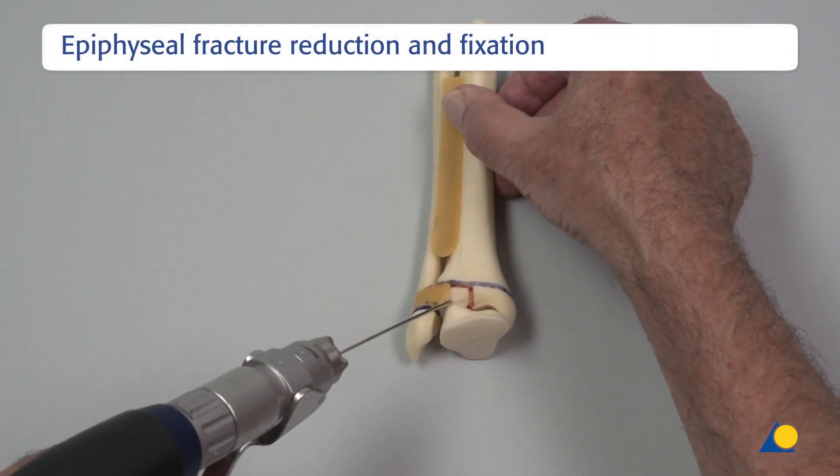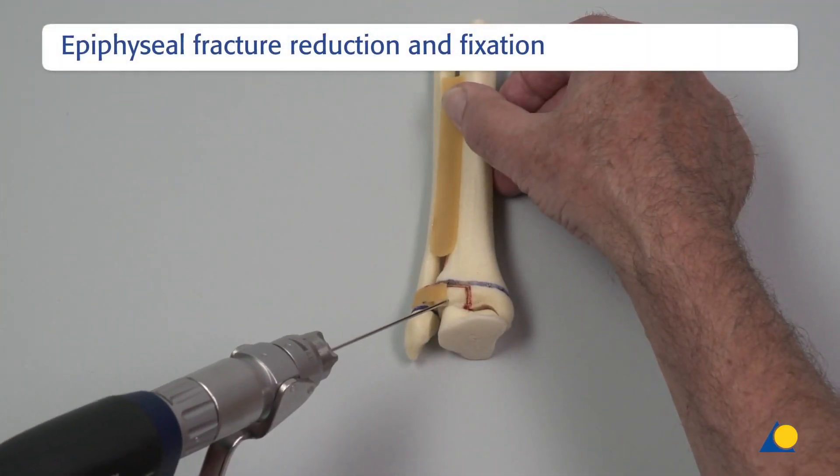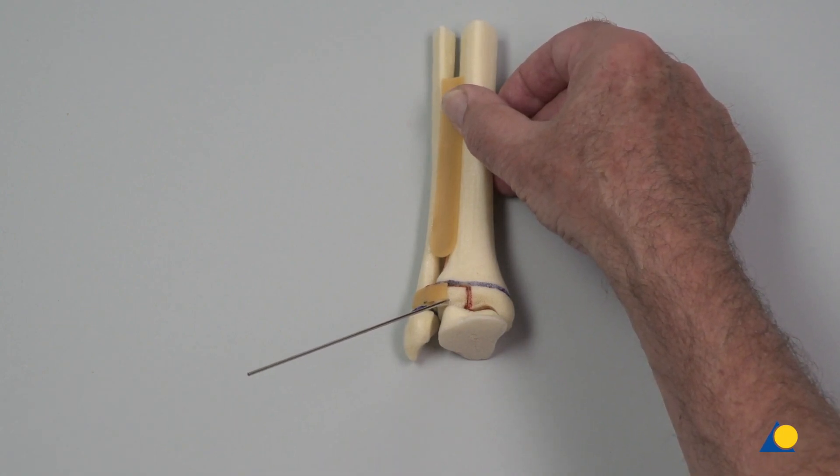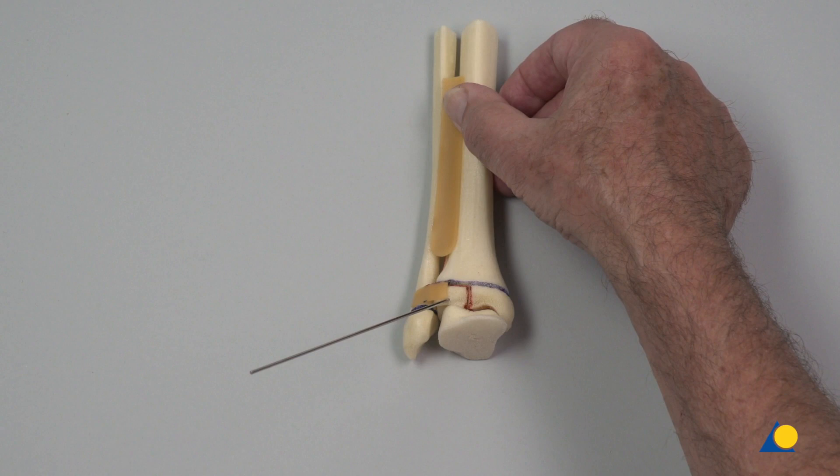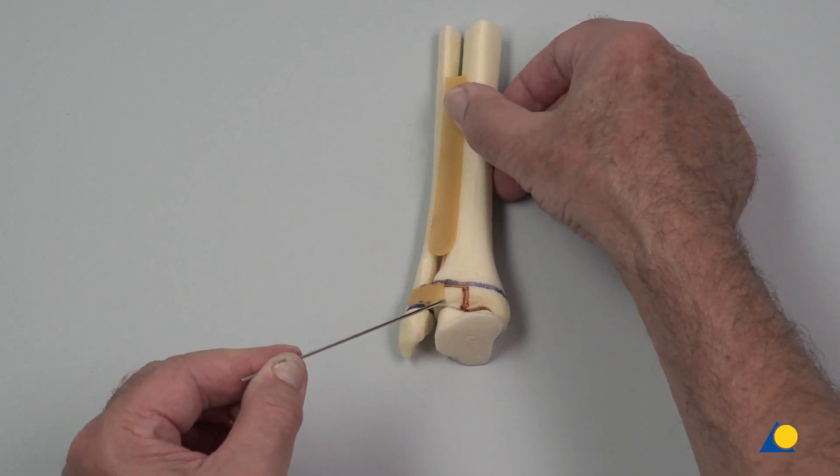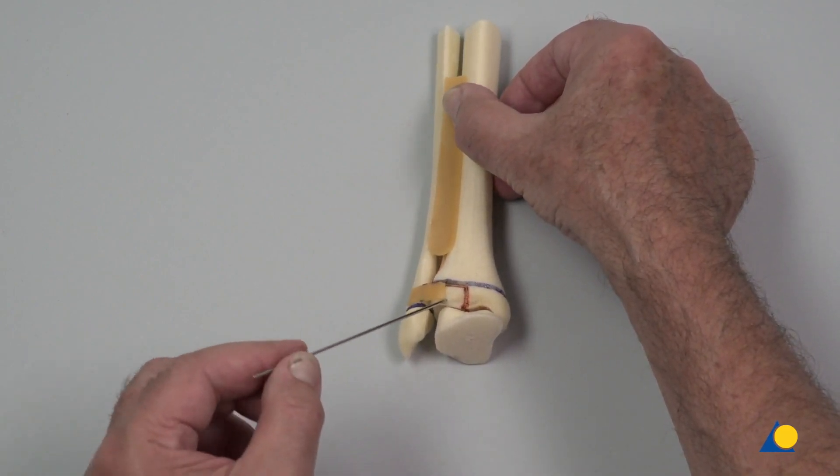Starting at the anterior lateral edge, directly above the insertion of the syndesmosis, a 1.6 mm non-threaded K wire is inserted. The K wire can be used as a joystick to manipulate the fragment for reduction.